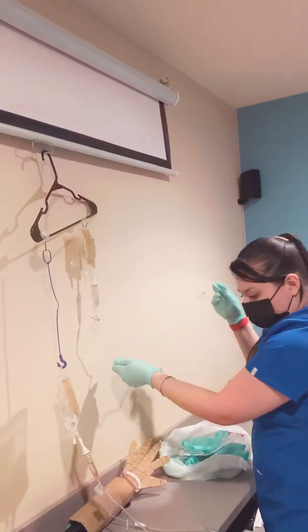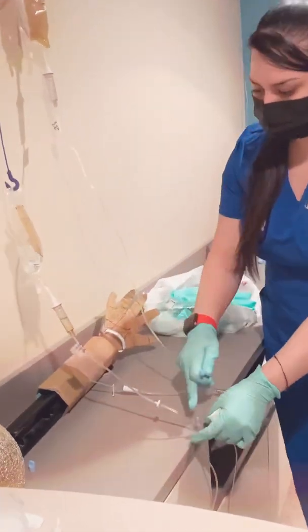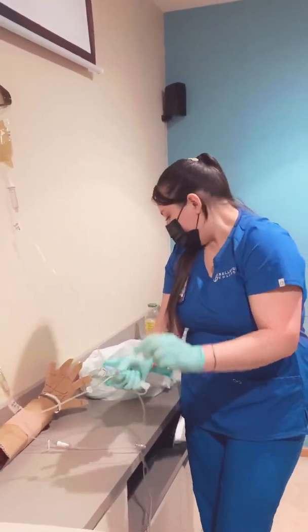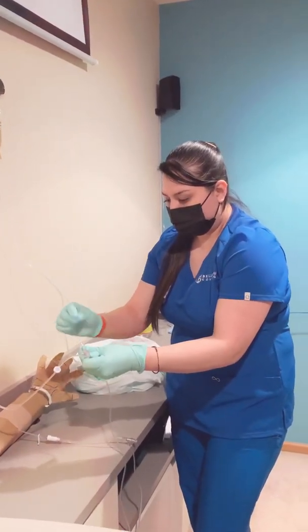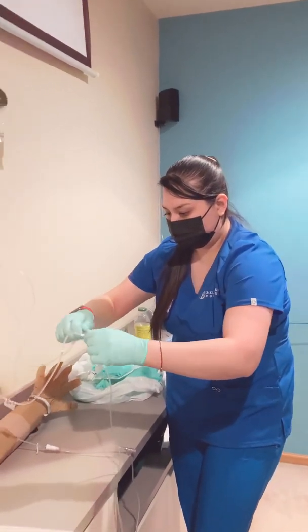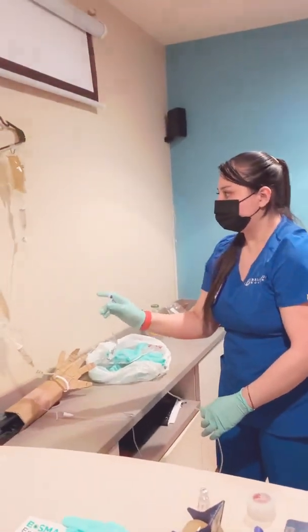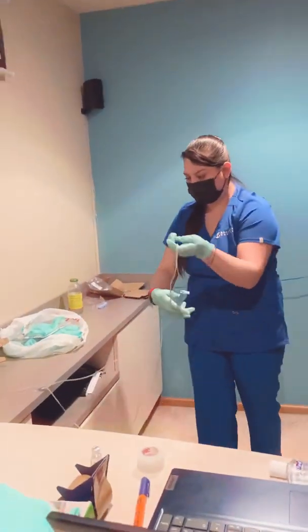Okay. And then you're going to grab your alcohol wipe and find the hub that is closer to the chamber. I found it, so I'm going to wipe for 30 seconds with alcohol. Sterile technique, remove your cap and attach it to the hub, just like that. And then you're going to unclamp the first one from the secondary line, and you're going to control your rate on your primary line.